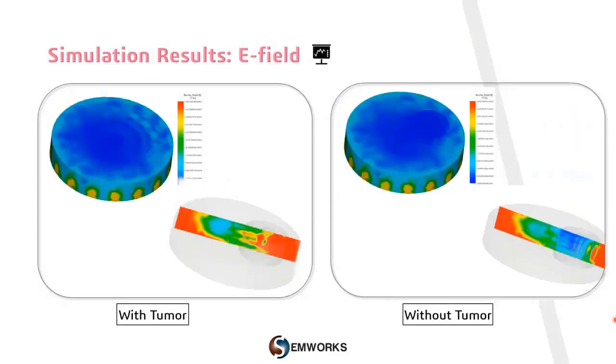Also, there is an increase of electric field intensity due to the presence of the tumor.